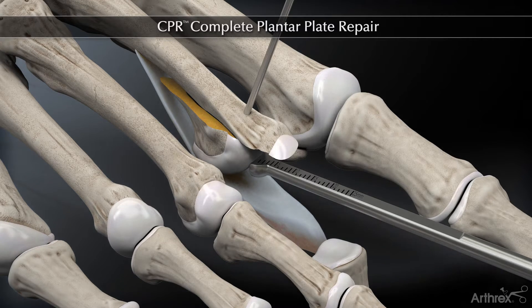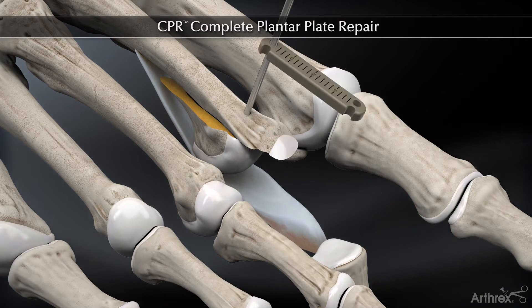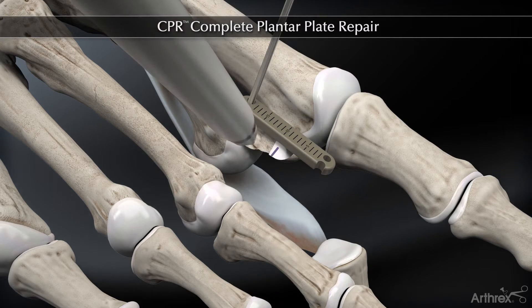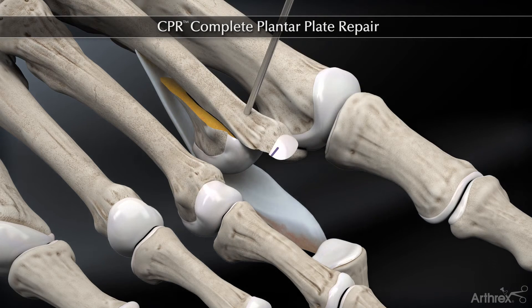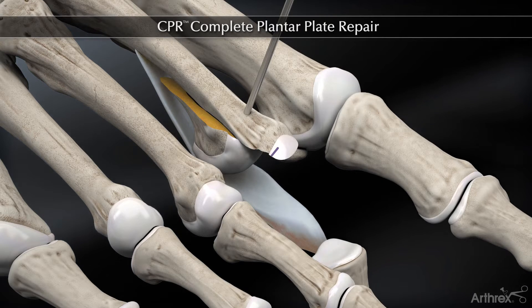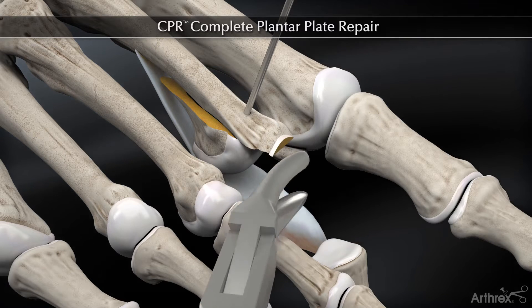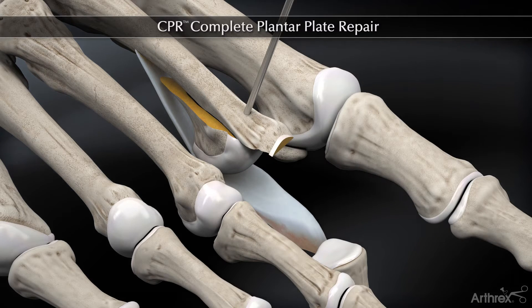Now we've fixed that translated Weil osteotomy with a vertical K-wire, and then it's helpful to measure the length of that dorsal flare and mark it. We'll see what it measured on the measuring device, and then we'll take about 3 millimeters from that flare, which gives us just a little bit more exposure.